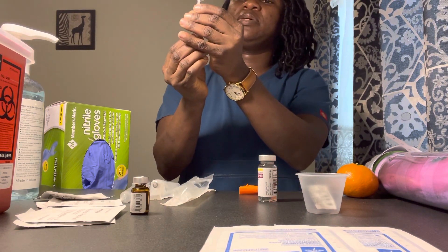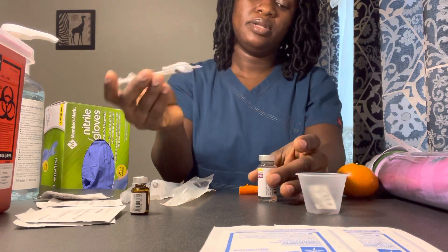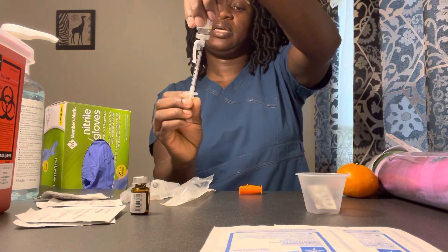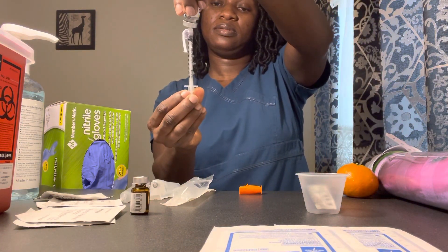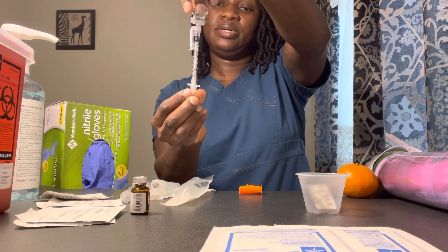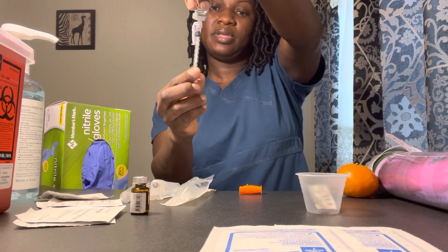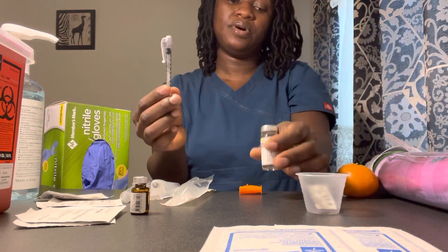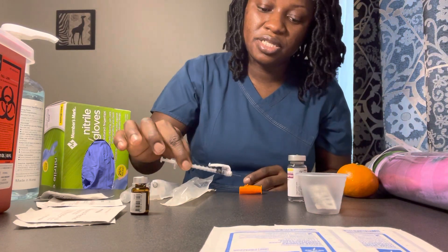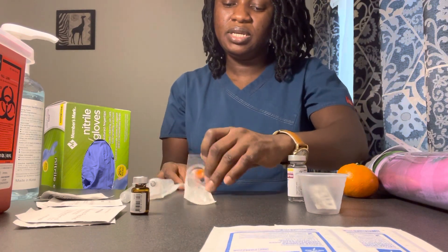I'm drawing 10 units. I have my 10 units and I will inject that in. Before I draw my 10 units, while drawing medications I will make sure I don't have any air bubbles. I have my 10 units drawn. Verify 10 units insulin Lispro. That is my second check for insulin Lispro.